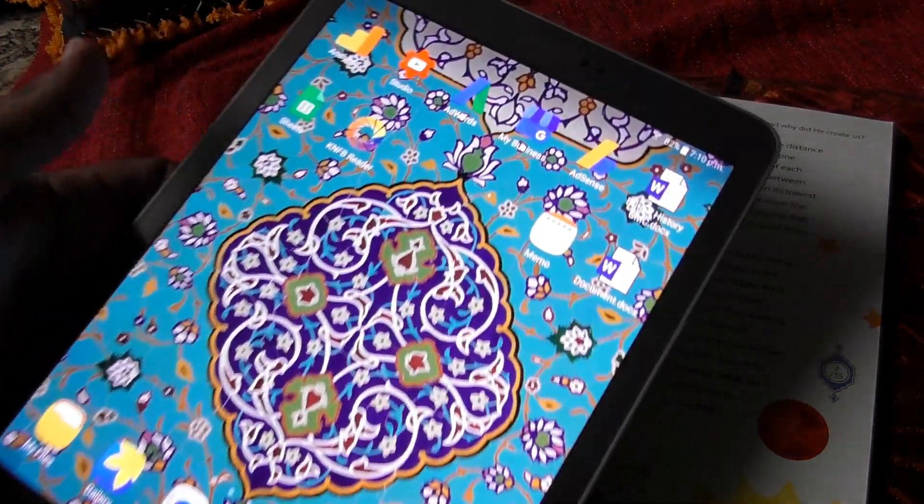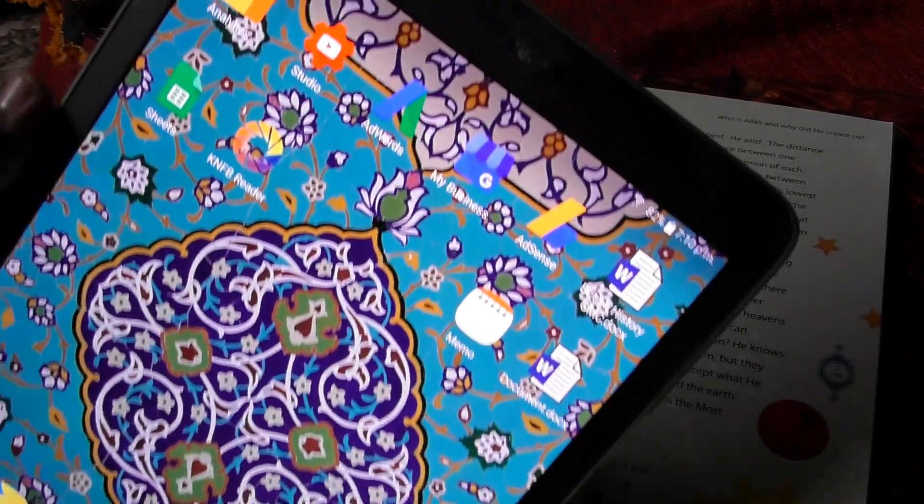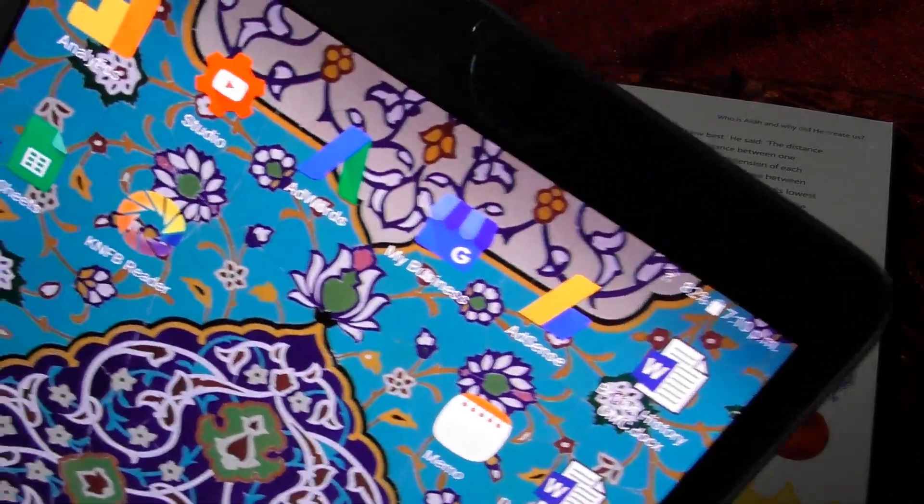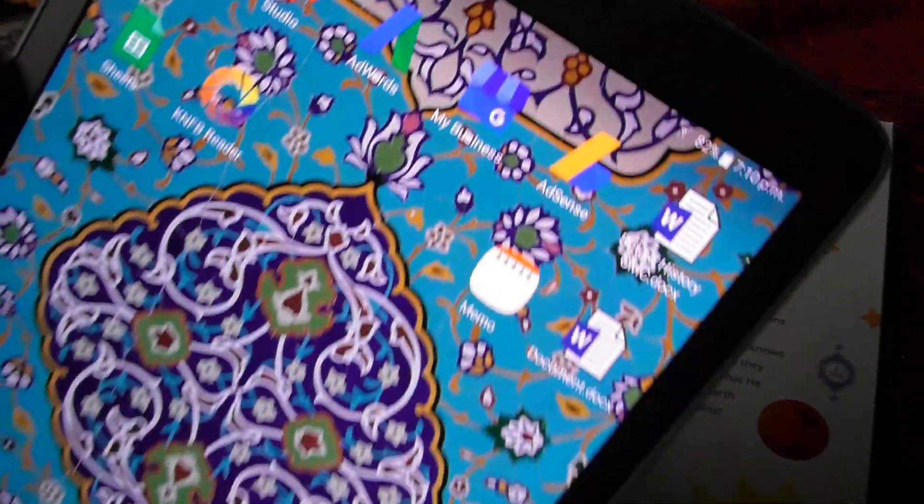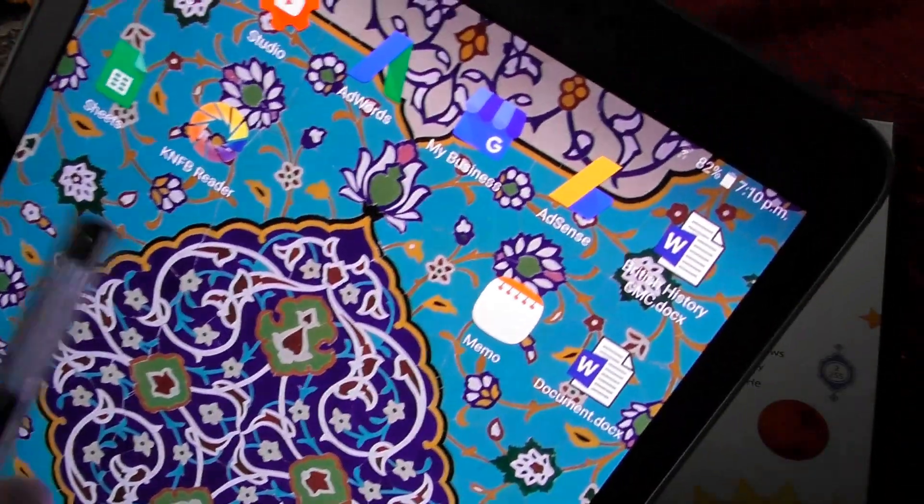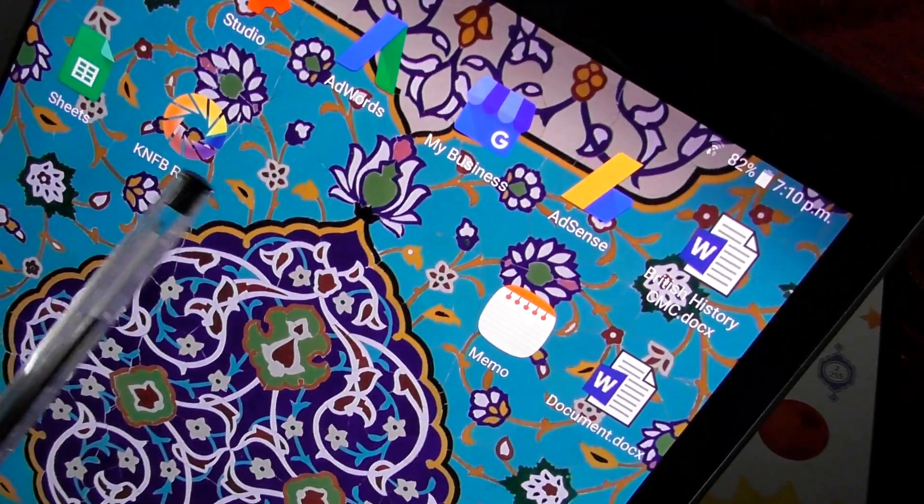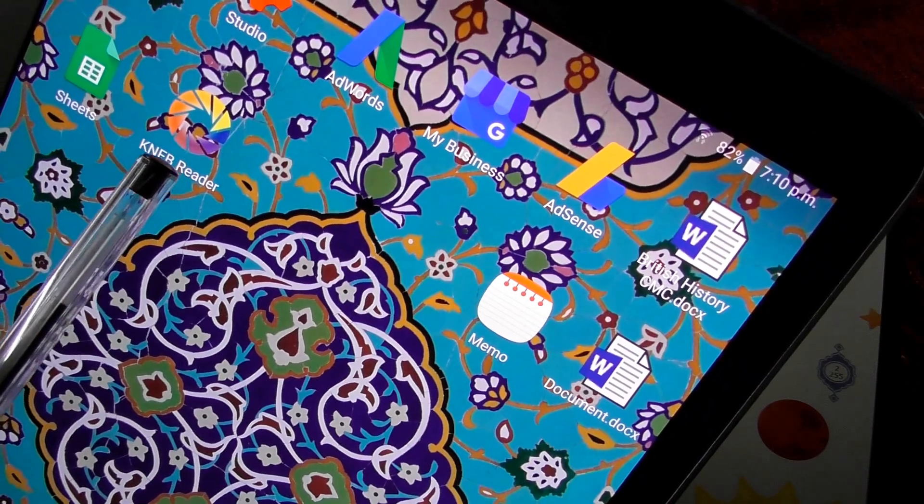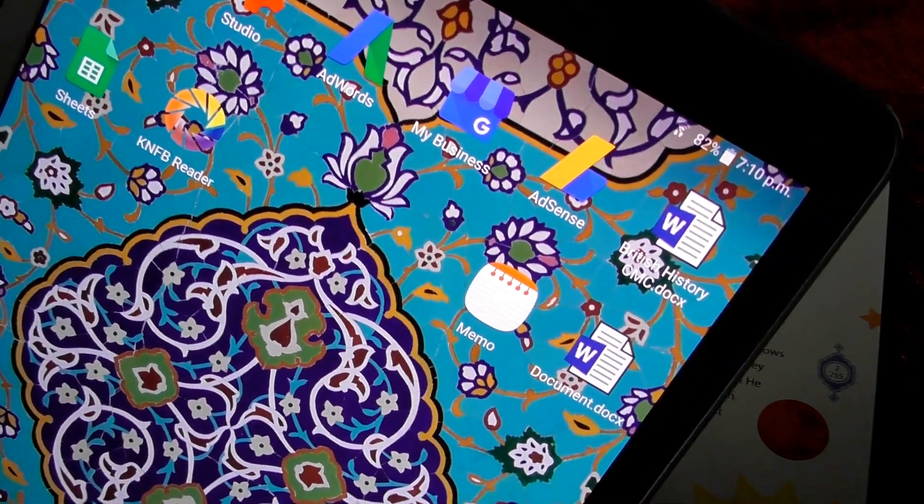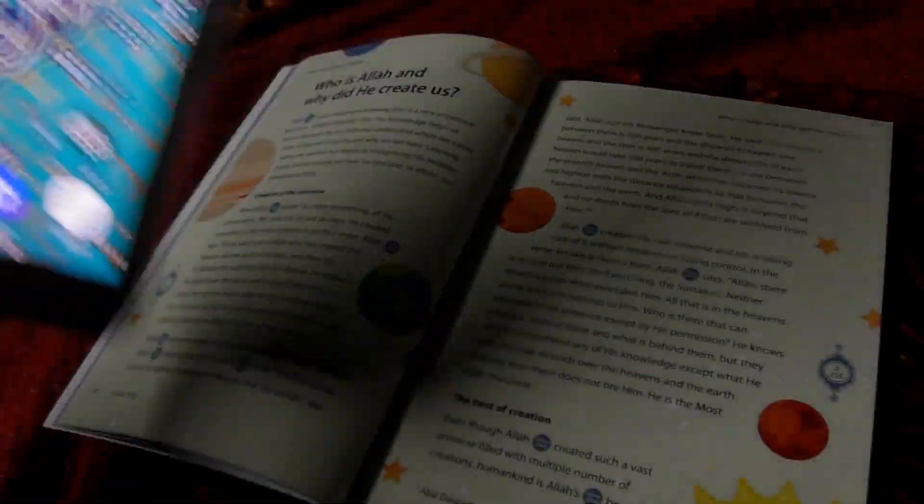So when you take the tablet, we have already downloaded it. If you look here, this is how the icon looks like. So what you need is, first of all, the text.